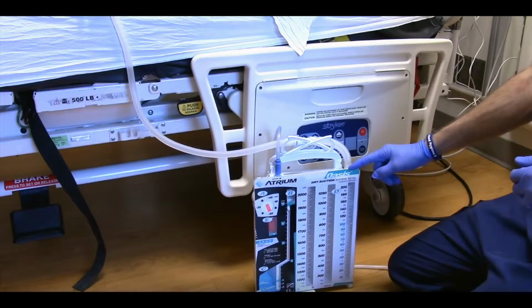So when you arrive at the bedside of the patient, you want to make sure you have a thorough clinical handover from the nursing staff and the doctors that are on site and have been caring for this patient prior to yourself. Whilst you appreciate the hands-off time while you have a clinical handover, you then want to make sure you do a full review of the whole system setup yourself.